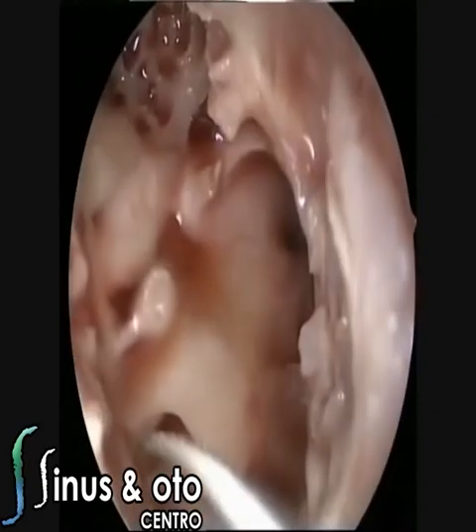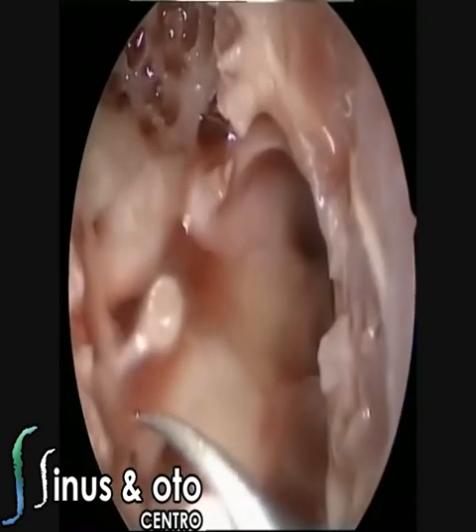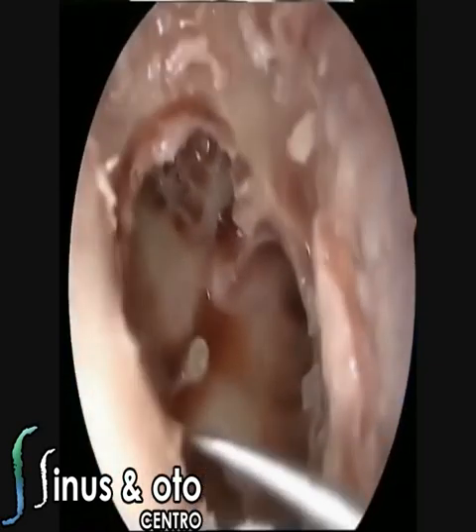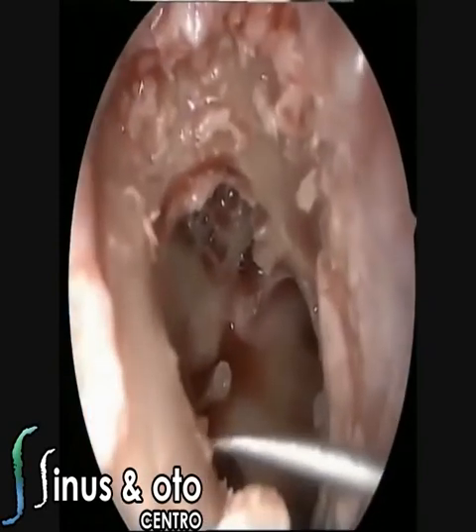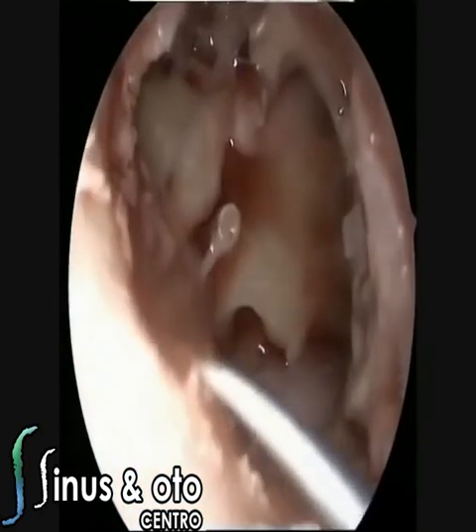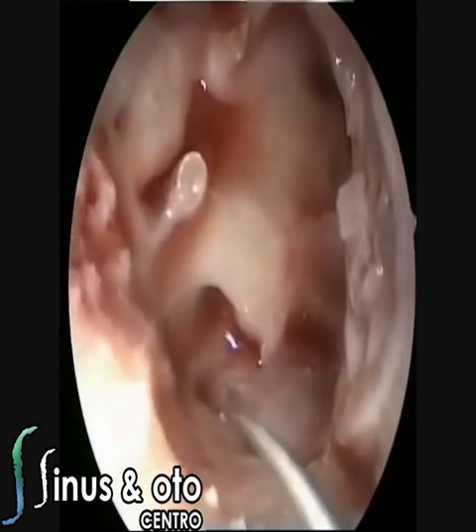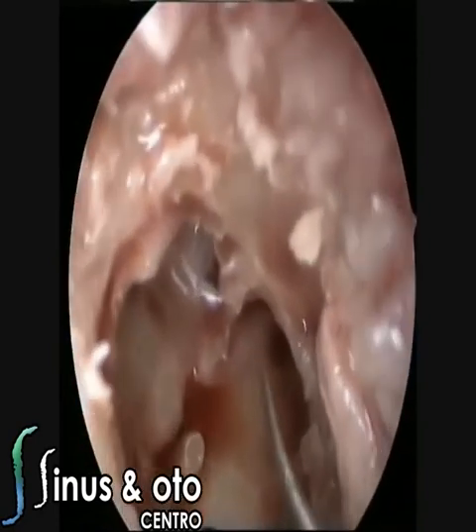And the best instrument, in our opinion, to inspect the middle ear and to perform surgery at the middle ear is the endoscope. So the endoscope is a preserve of the middle ear. The middle ear is a preserve of the endoscope. And the mastoid is a very nice structure, a very nice anatomical landmark for the microscope. So ear surgeons, in our opinion, should learn how to master both instruments, endoscopes and microscopes, to try to provide the best care possible for the patient.